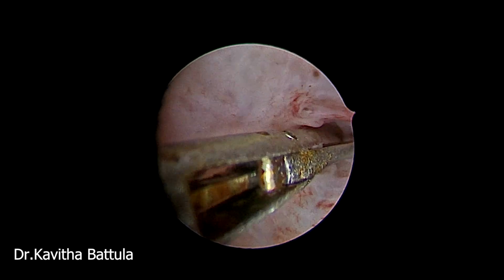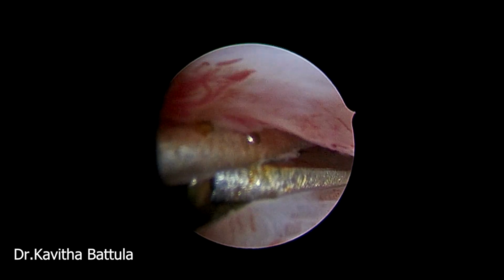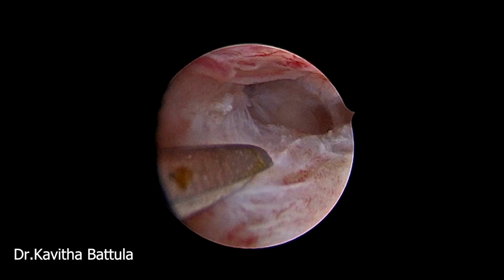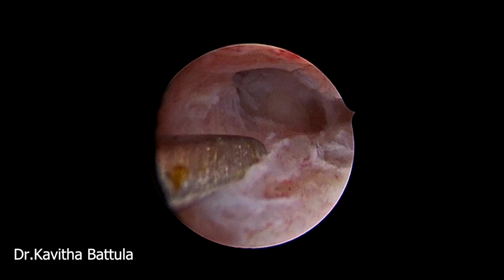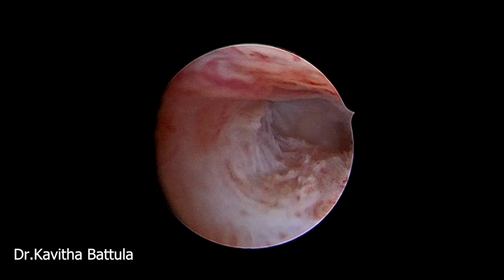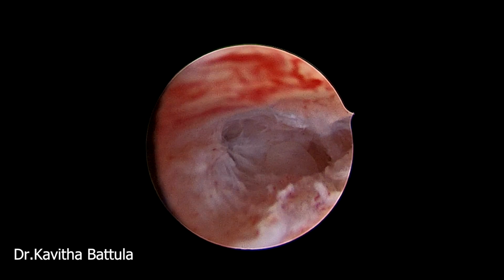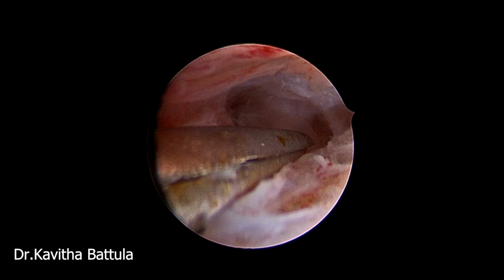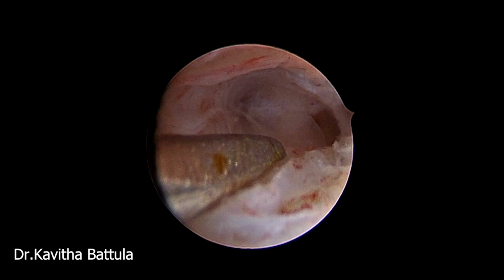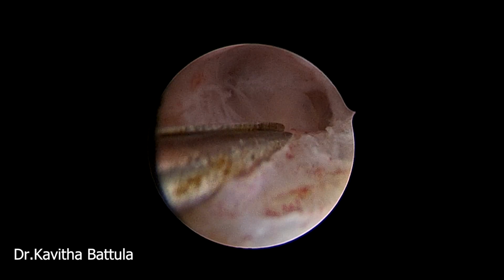If we are going into a false track, we can see the ragged part of the false track. It's not a smooth cavity, so we can identify in that way. The part just above the level of the internal os will be ragged. So that indicates that we are not in the right direction. We are onto the right side of two supposed cavities, but it wasn't like a normal cavity.